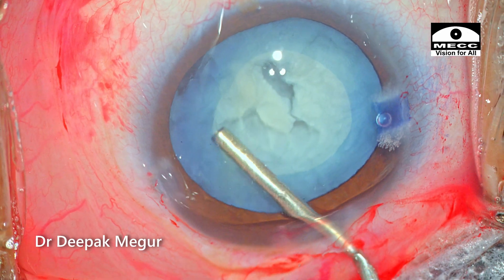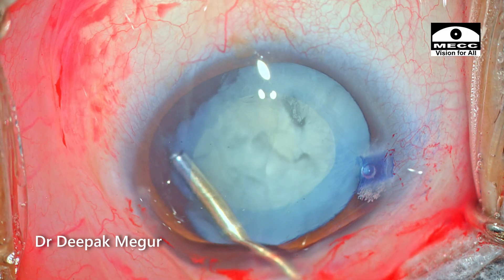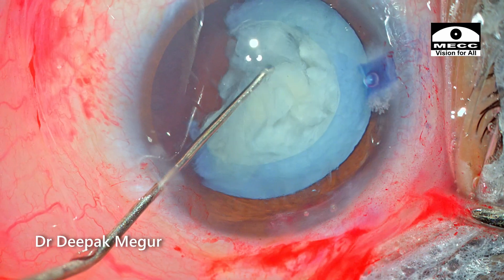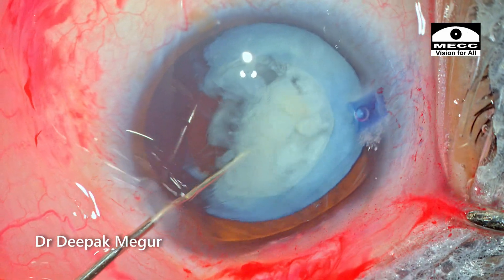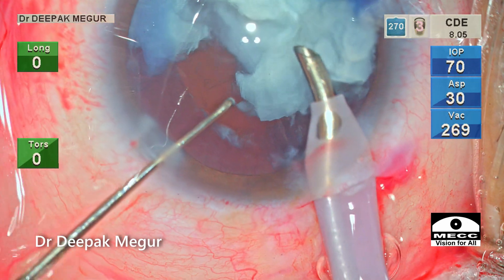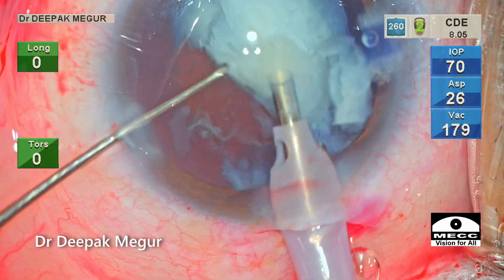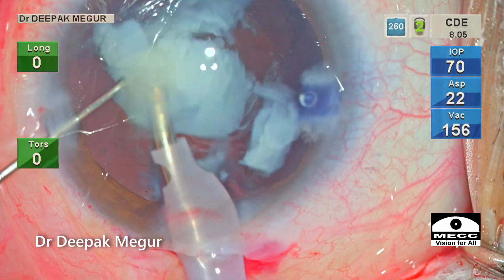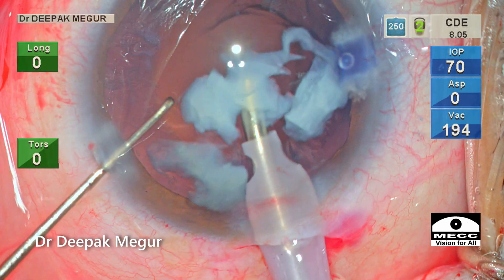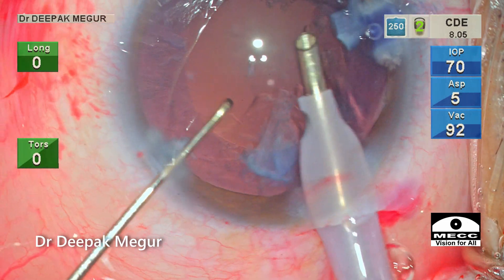At this point my only concern and suspicion is about the possibility of a similar hole in the posterior capsule. I put in OVD under the rhexis, trying to levitate one edge of the nucleus out of the bag. The prolapsed edge of the soft nucleus is consumed. Similarly, the rest of the nucleus is carefully negotiated and eventually consumed. As the last bit of the nucleus is being aspirated, I am wary about the state of the posterior capsule. Thankfully there was none — the posterior capsule was intact.